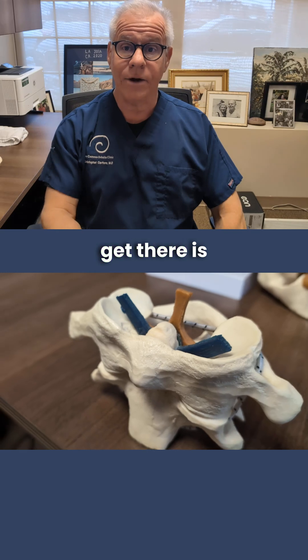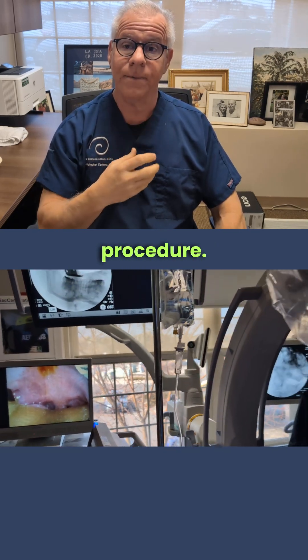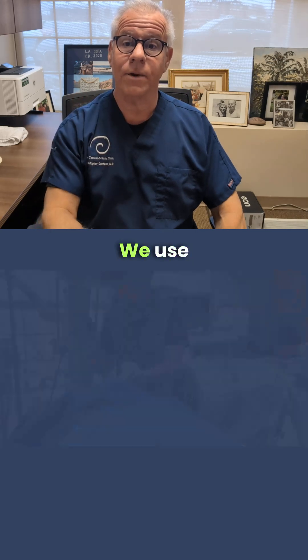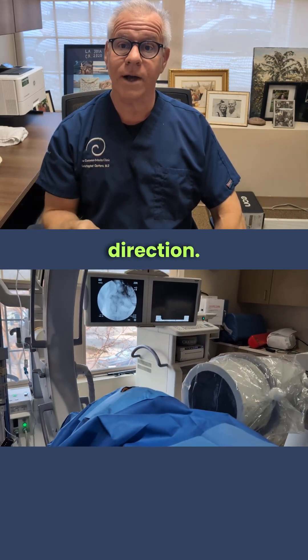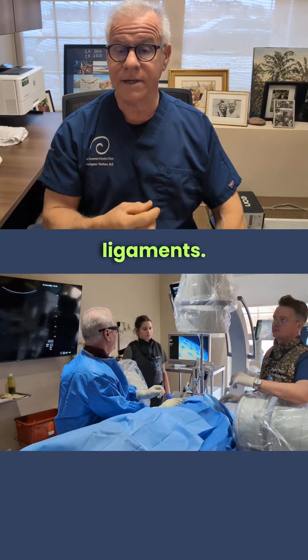The only way you can get there is from the front, so it's a transoral procedure, and there's a lot going on in this procedure. We use endoscopy, we use stereotactic C-arm — one going one direction, another C-arm going the other direction. We use contrast confirmation to make sure we're in the right ligaments.